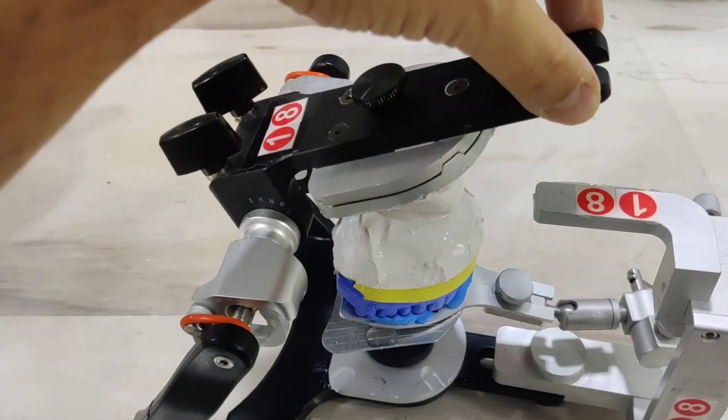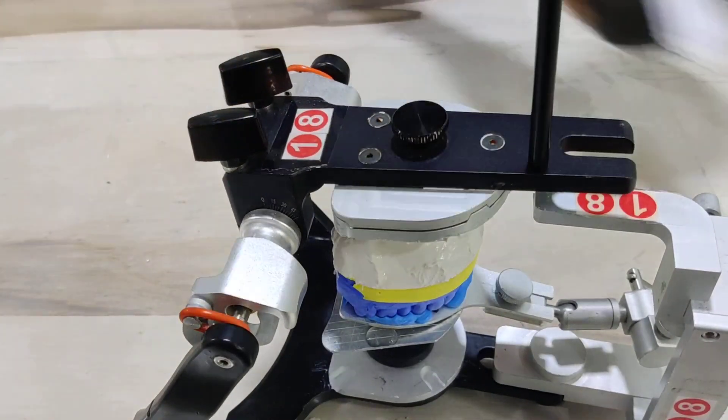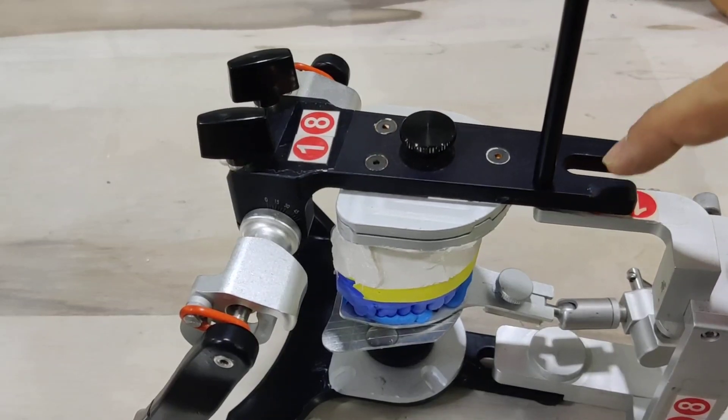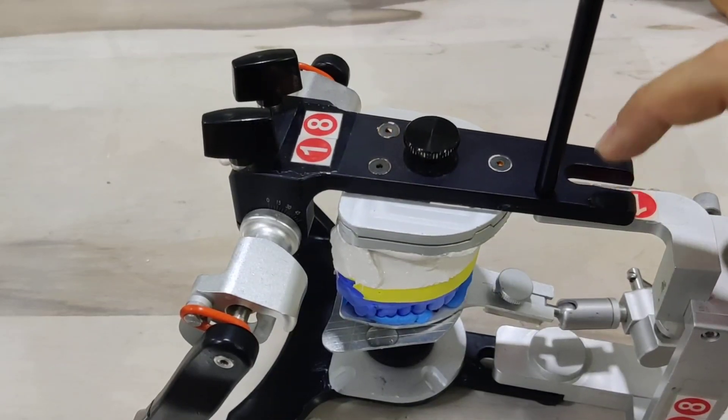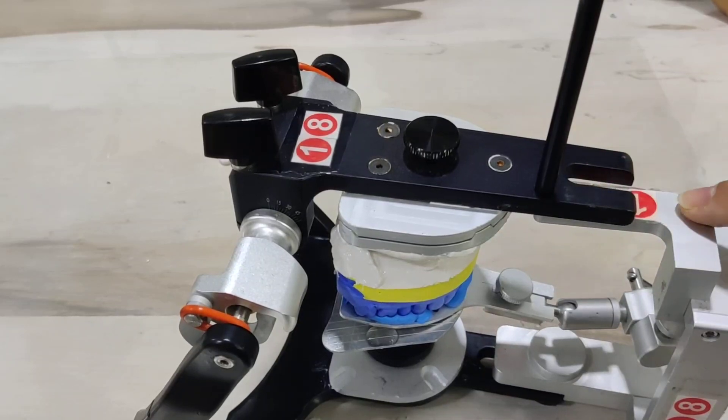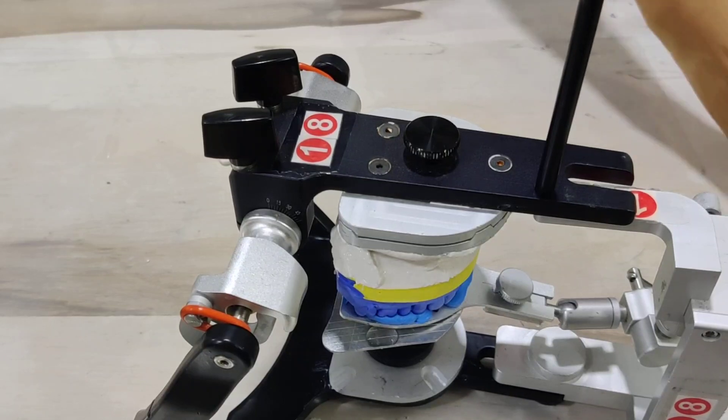As I tap, excess material keeps coming out and it is now that the upper member of the articulator is contacting the indirect mounting jig.